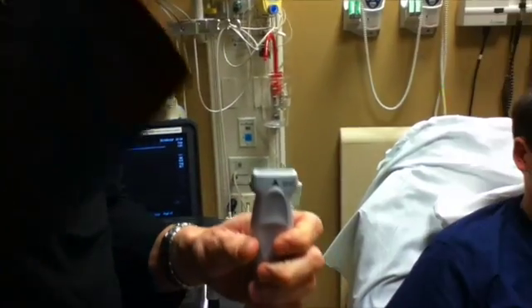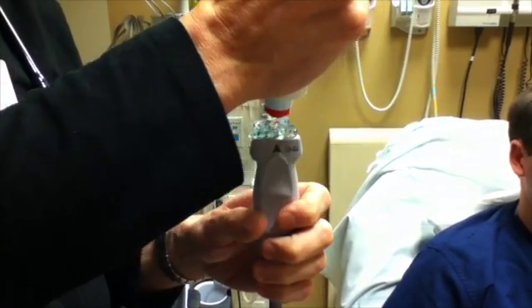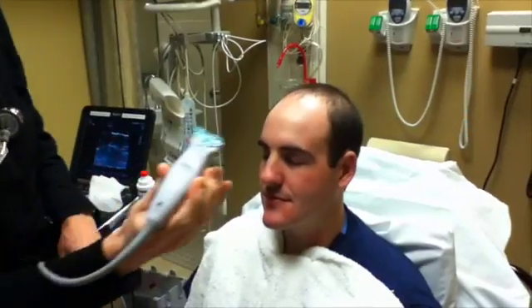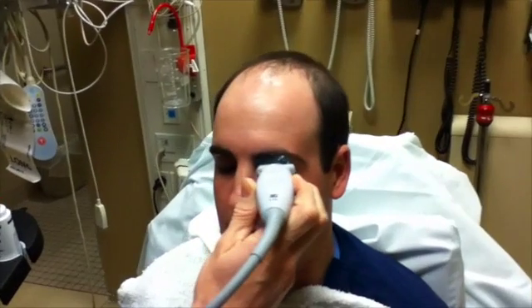To begin with, place a large amount of ultrasound gel on the probe if the patient is upright, or on the closed eyelid if the patient is supine. Be sure that the eyelid is closed before applying gel to the eye. There is no need to cover the eye with Tegaderm or other protective barrier.